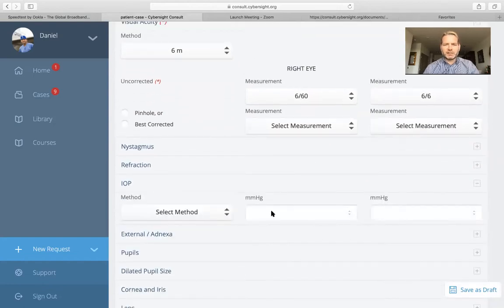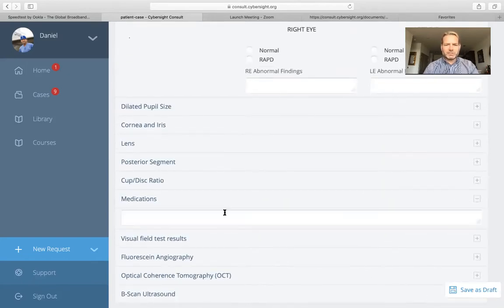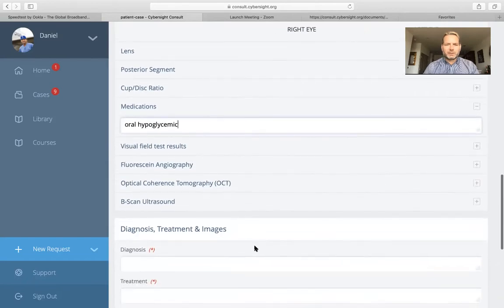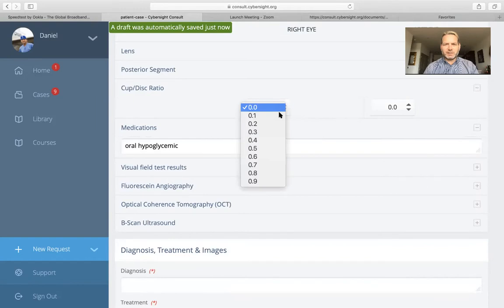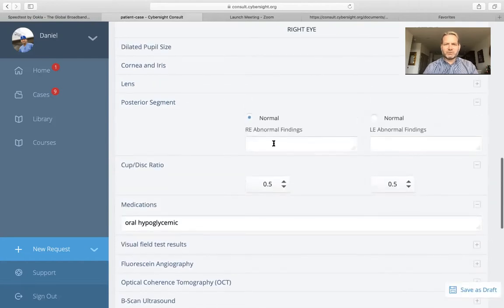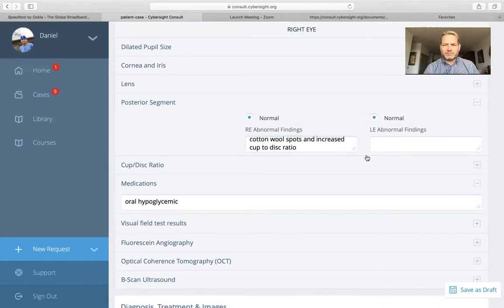She's a glaucoma suspect, so I'll go ahead and add in some intraocular pressures — 25 on the right and 25 on the left. Scrolling down to medications, she's a non-insulin-dependent diabetic, so let's assume she's on an oral hypoglycemic. For cup-to-disc ratio, let's give her a moderate ratio on both eyes of 0.5. For the posterior segment, I'm going to make the right side abnormal because I have a set of right eye fundus photographs, noting cotton wool spots and an increased cup-to-disc ratio.